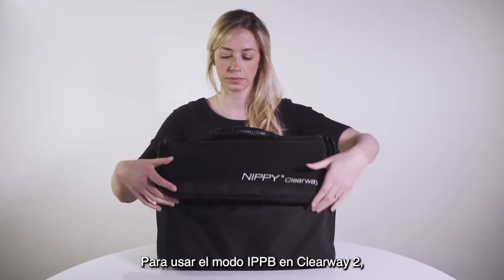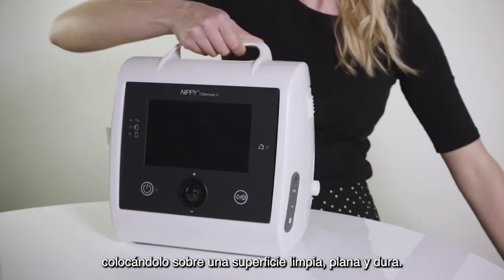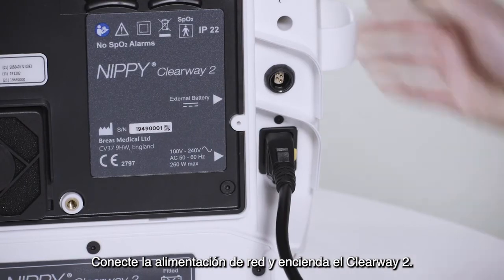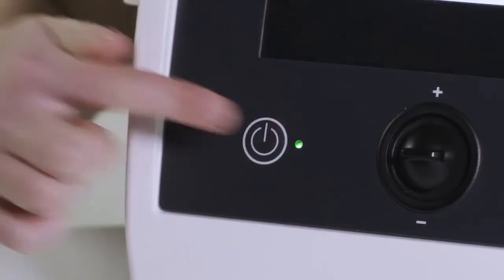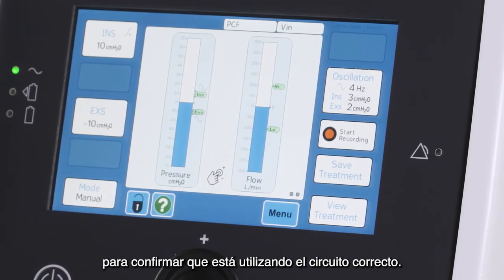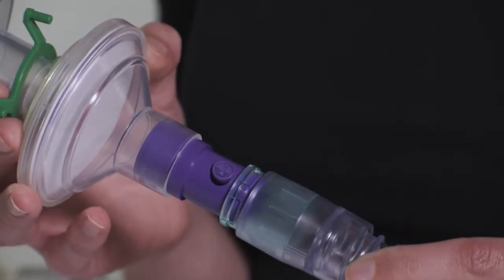To use the IPPB mode on the Clearway 2, set up the device as normal by placing it on a clean, flat, hard surface. Connect the mains power and switch the Clearway 2 on. Press the green check button to confirm you are using the correct circuit. In IPPB mode, a circuit with a leak port must be used.